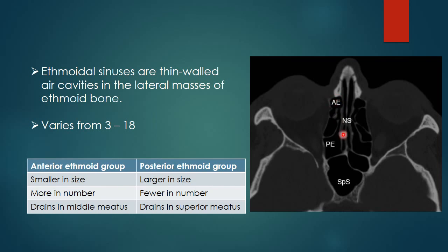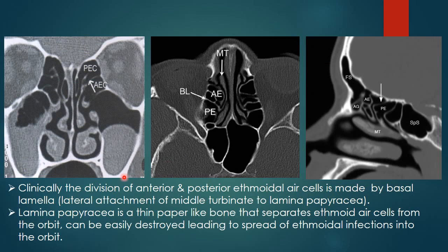You can see the anterior ethmoid sinus, which is small, and the posterior ethmoid, which is large. Clinically, the division between anterior and posterior ethmoid air cells is made by the basal lamella. The middle turbinate is attached to the medial wall of the orbit through this structure called the basal lamella, which is the division between anterior and posterior ethmoid cells. The ethmoid cells anterior to the basal lamella are anterior ethmoid cells, and those posterior to it are posterior ethmoid cells. This can also be seen in the axial CT and sagittal images showing the middle turbinate attached to the orbit through the basal lamella.